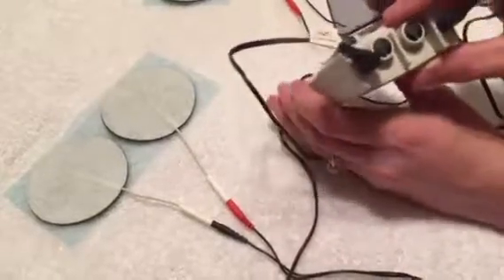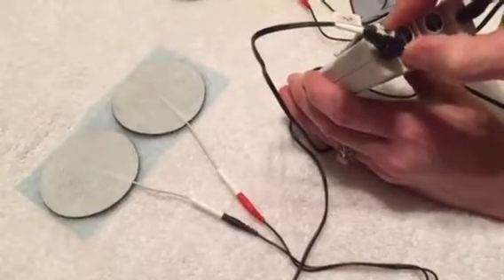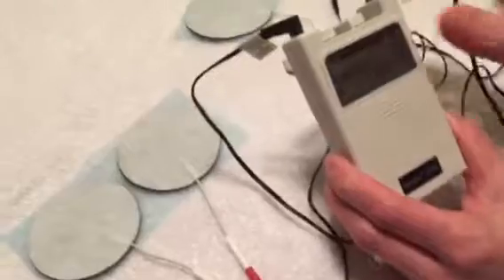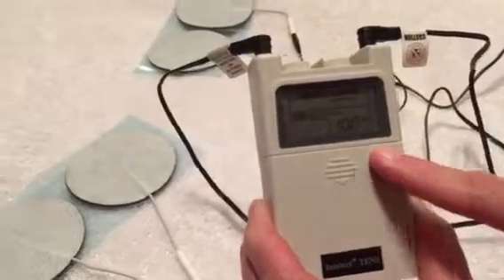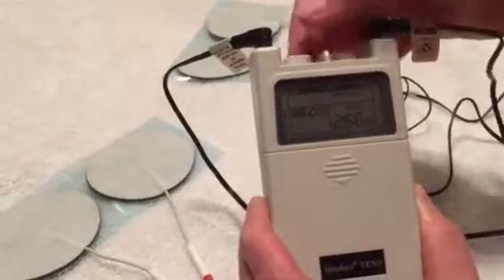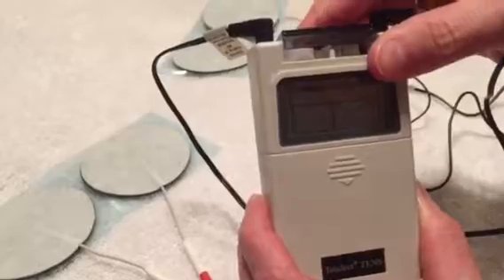To turn the unit on, turn the dial until you hear a click and a beep. If we look at the front screen, we see that there are numbers and a battery icon, which means there is a good battery, so we're ready to go. I'm now going to turn the unit off and we'd be ready to put the electrodes on the patient.